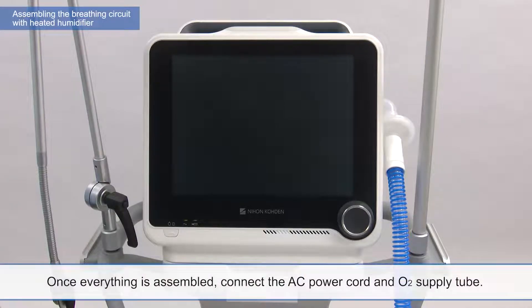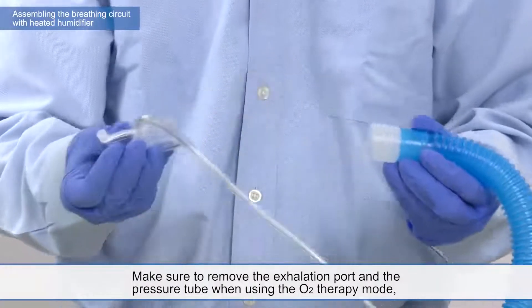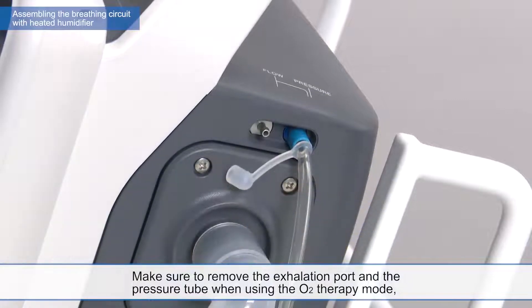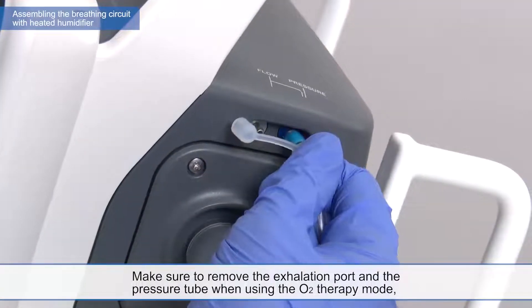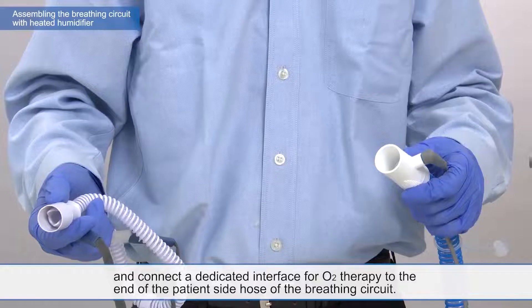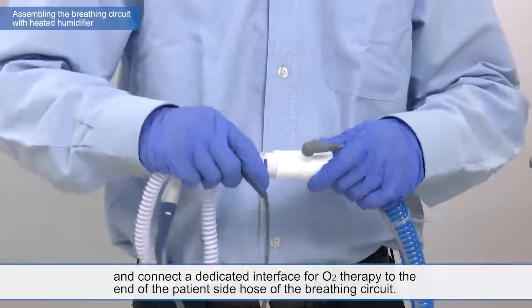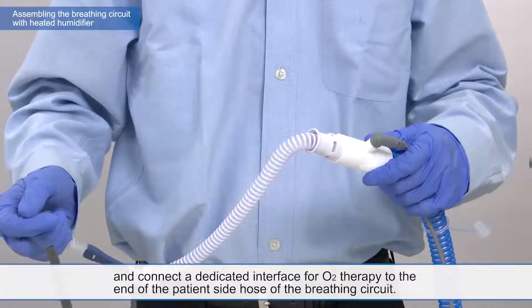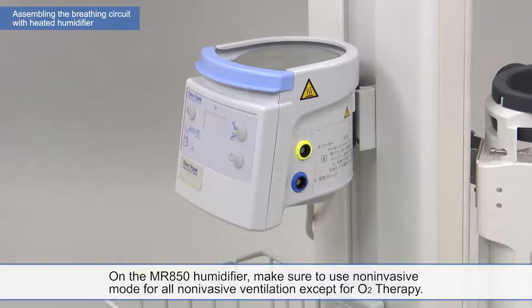Once everything is assembled, connect the AC power cord and the O2 supply tube. Make sure to remove the exhalation port and the pressure tube when using the O2 therapy mode. And connect a dedicated interface for O2 therapy to the end of the patient side hose of the breathing circuit. On the MR850 humidifier, make sure to use non-invasive mode for all non-invasive ventilation except for O2 therapy.